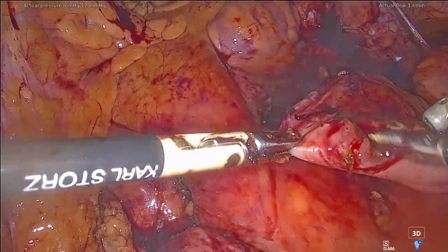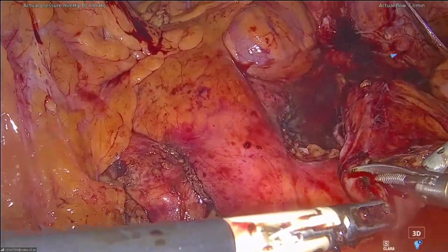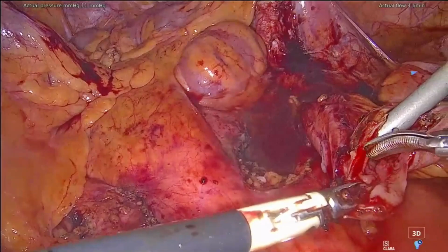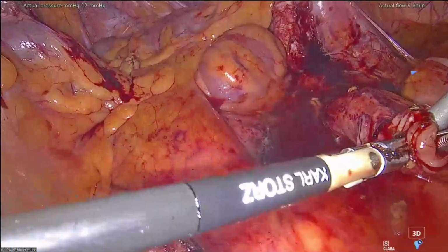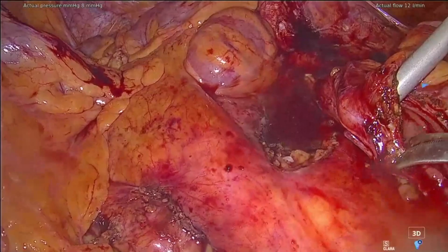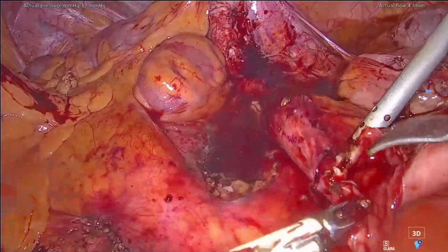So you didn't cut the right ureter, as you can see. You had the proof now. Not yet. Okay. Just to coagulate a little bit. I have to be careful when I manipulate my flap. Okay, place inside the bowl like that, yes. Wait, once again, camera more on the right side, yes. Place it inside here.